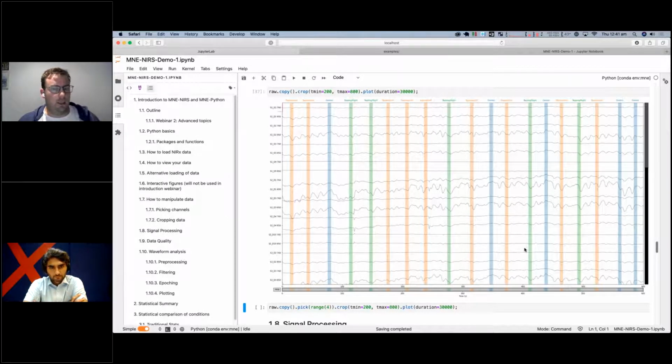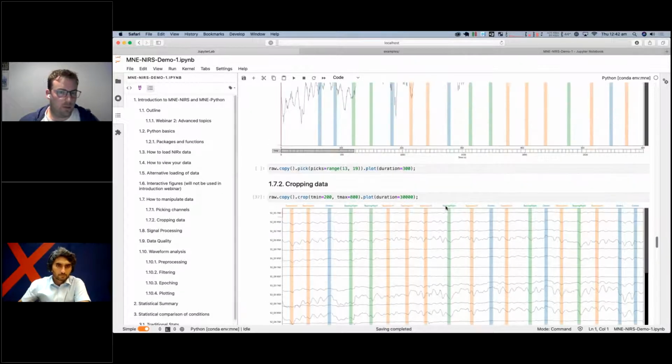We had another question in the registration. Someone asked, what are the best practices for infant and juvenile fNIRS data analysis? I haven't done a lot of infant analysis, but I imagine they move a lot. I imagine there are gaps of data where you want to ignore it because they were coughing or something, or they were just not doing what you asked.